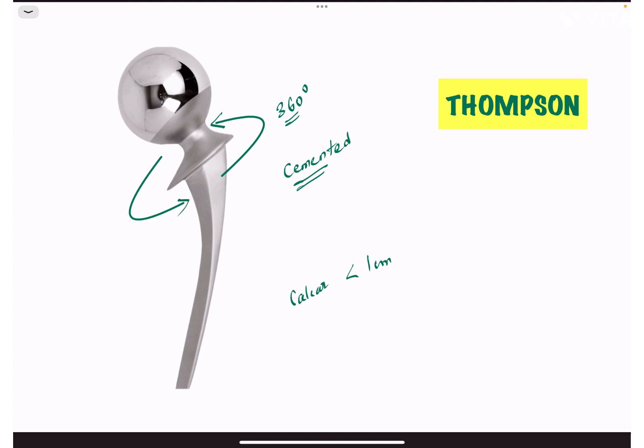In Thompson's hip prosthesis, the parts are the head, neck, collar, and stem. The collar is all around — that is, there is a 360-degree collar. Therefore, it is used in cases where the calcar is less than one centimeter. Thompson's prosthesis is used as a cemented hemiarthroplasty hip prosthesis.